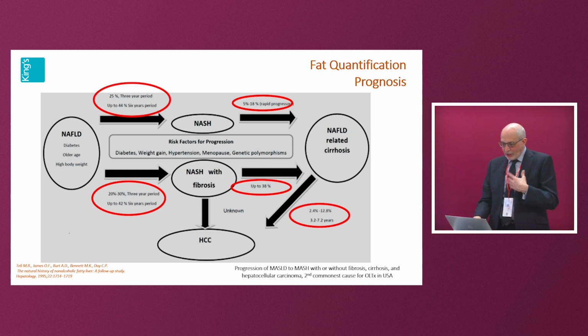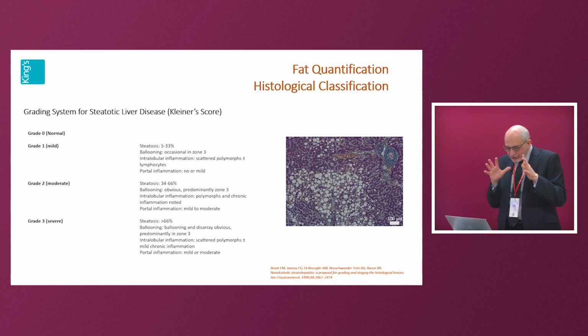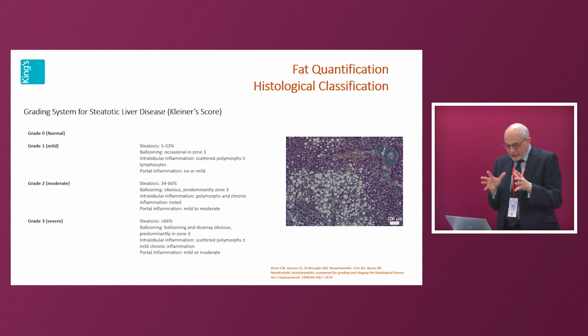But whereas radiologists, we can quantify this, and this is what you're aiming to do with all these parameters. The standard, the reference standard for fibrosis, was biopsy, and that is changing, but the gold standard for steatotic liver is a biopsy. And you classify into grades S0, S1, S2, S3. And this more or less equates to mild, moderate, and severe, those famous terms that the radiologist uses.